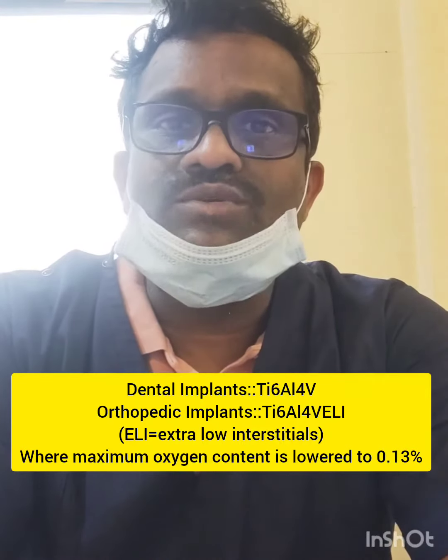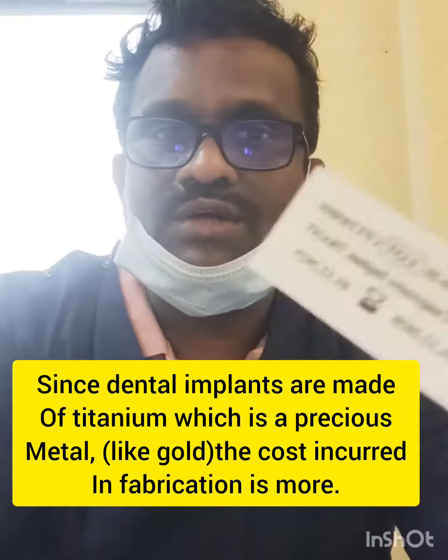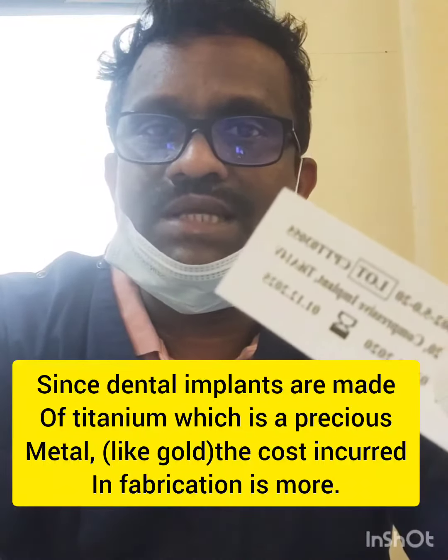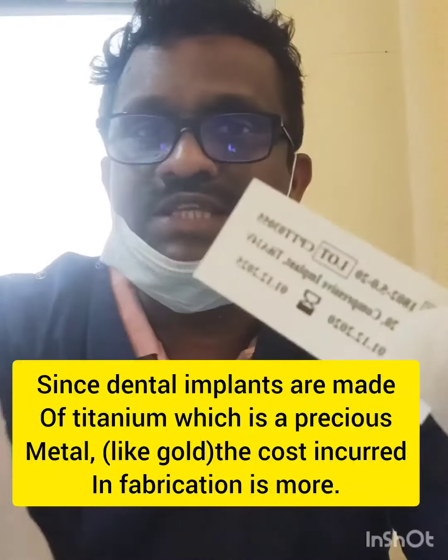The manufacture date is also mentioned on the label, along with the diameter and length of the implant. This is what the single implant kit contains, and the label explains the complete details of the implant.